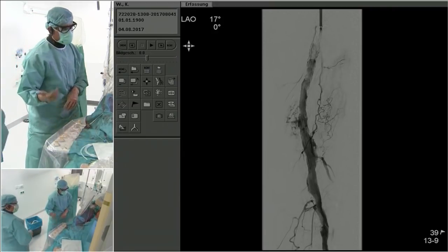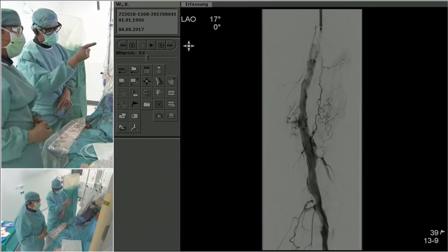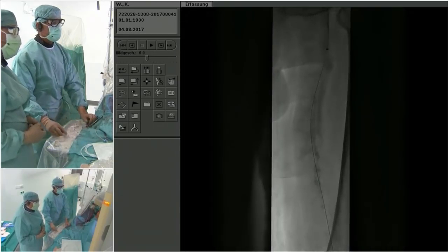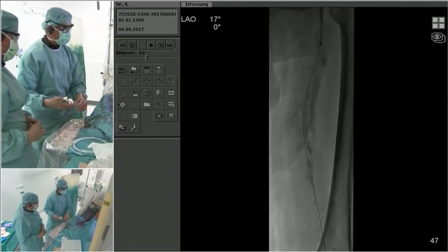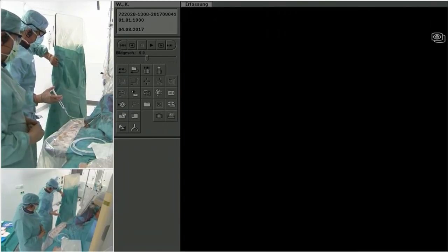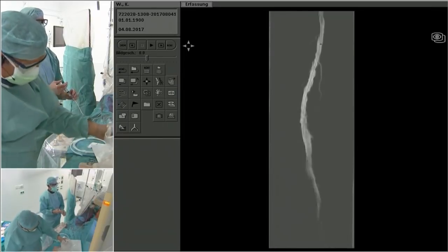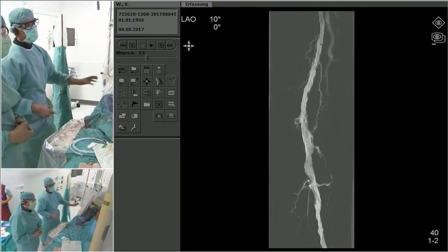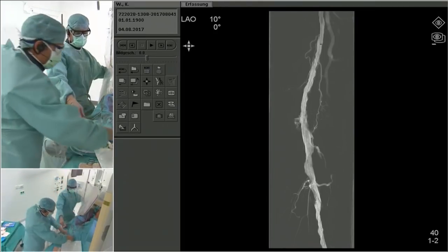And we're going to take it in now. We will be careful to at least save that collateral distal here. And after that, we will go in once again with a 7/20 millimeter balloon for post-dilation, and then take the Supera stent in. Okay?